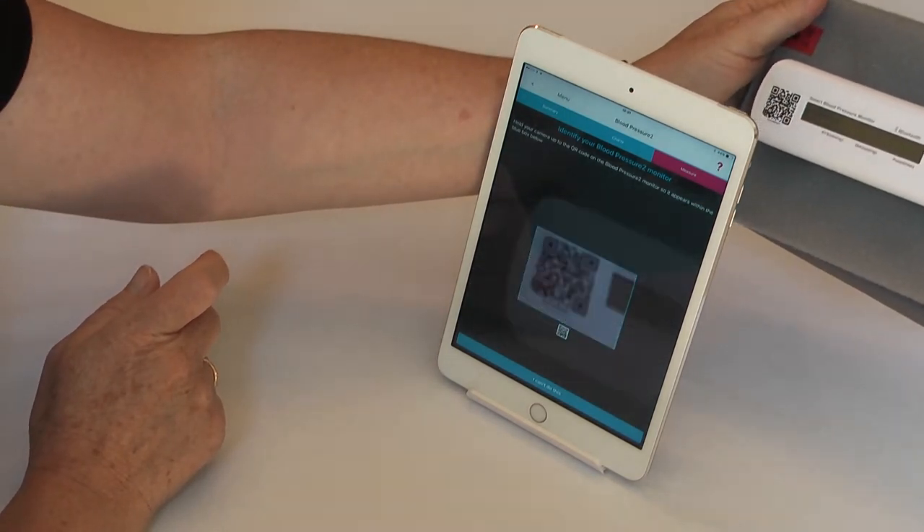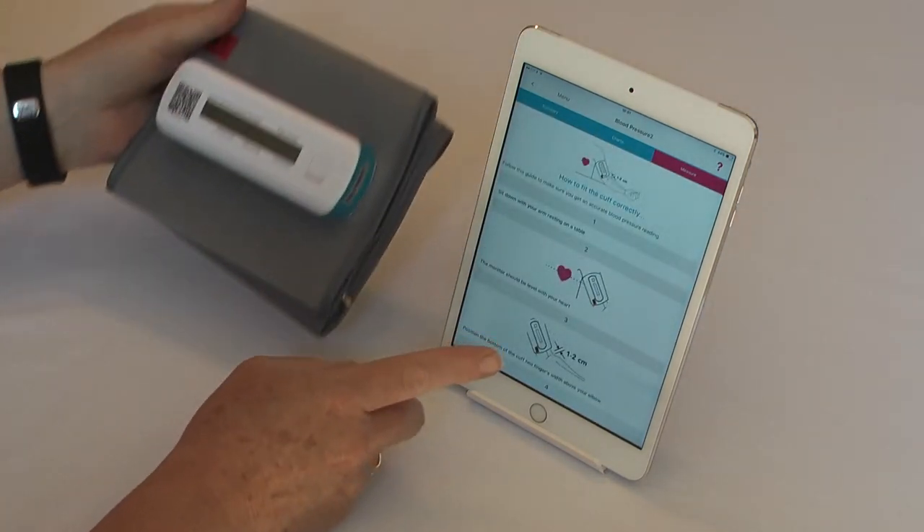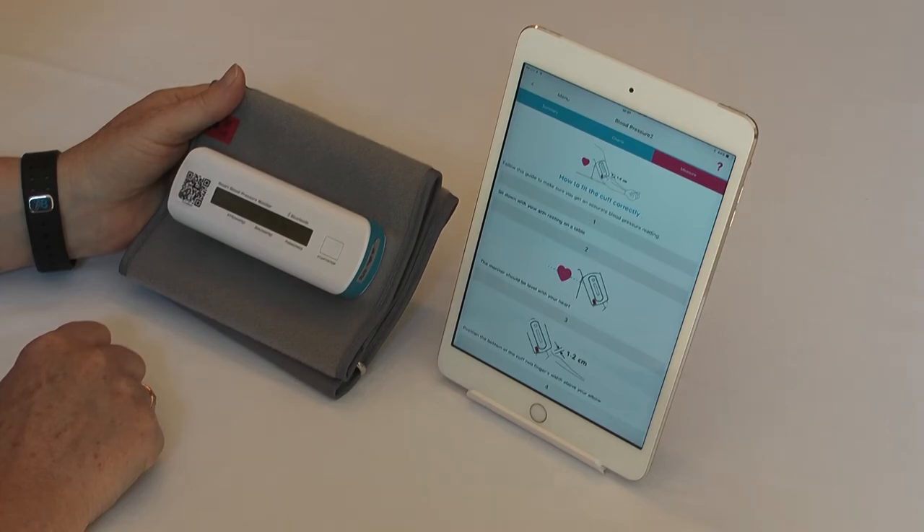It will immediately scan it and will then take you to the app page which gives instructions on how to fit your blood pressure cuff correctly.